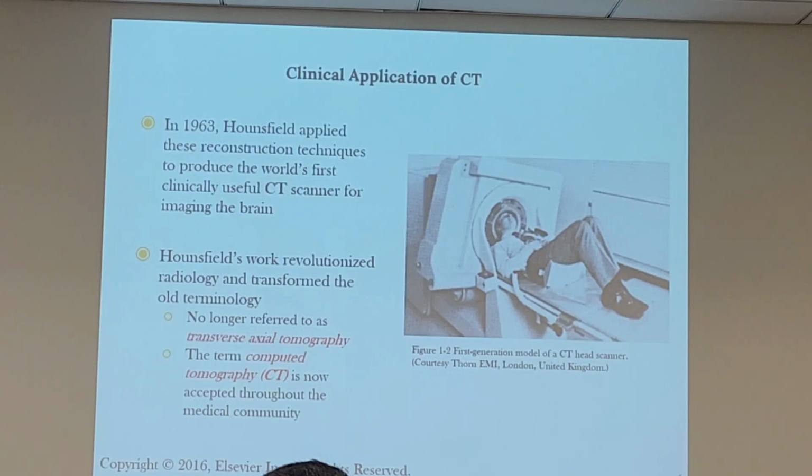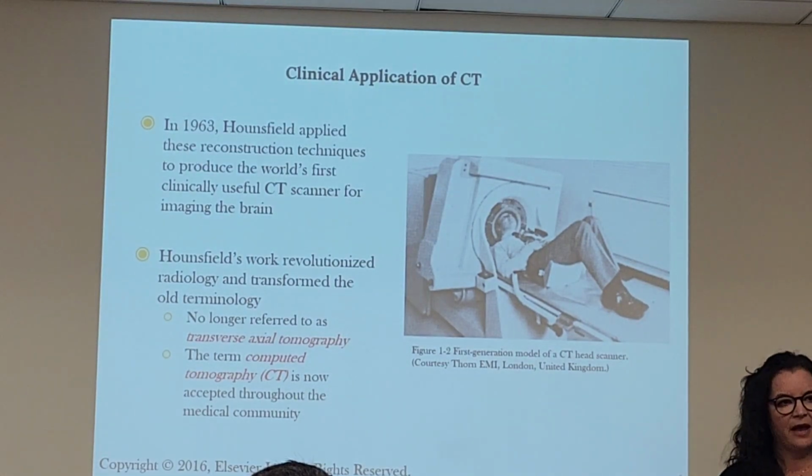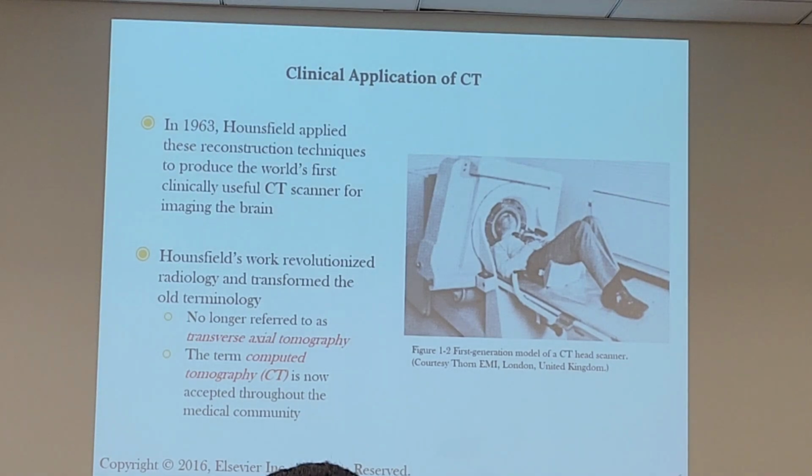And so we're taking all of the data that was provided from the axial collections, the data acquisition from an axial image as they're slicing through, putting that all together using a mathematical algorithm to say, voila, we have a sagittal image, without having to take a sagittal image or change the position of the patient at all.